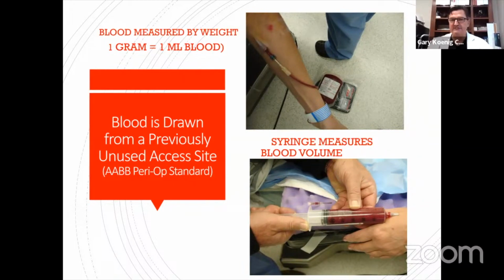The top slide shows blood being drawn off in a blood bag for PRP, which is rarely used because all the cell saver machines have an option to make PRP, and it requires more blood to do so. Today, small volumes of blood are utilized in typical 60 ml syringes to process and make PRP or platelet gel.